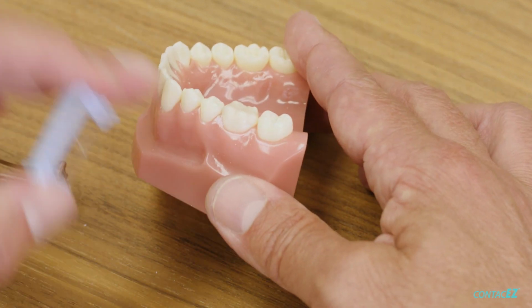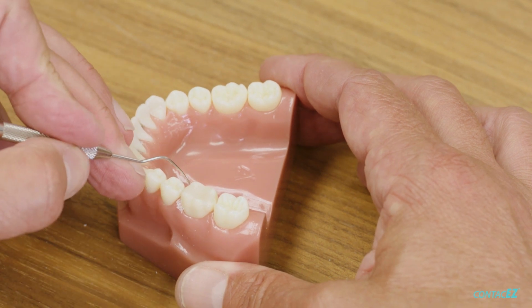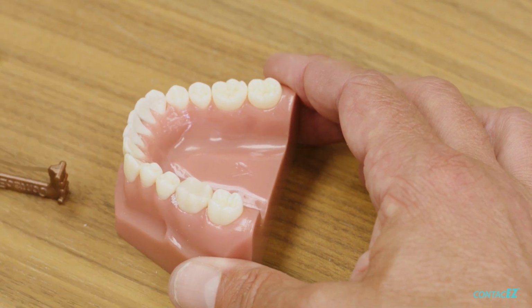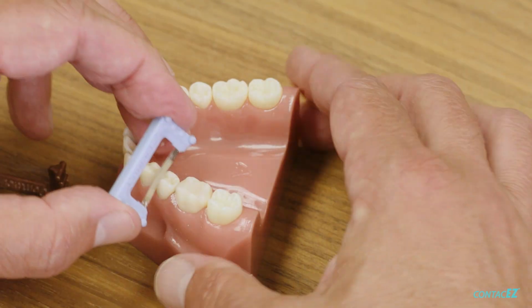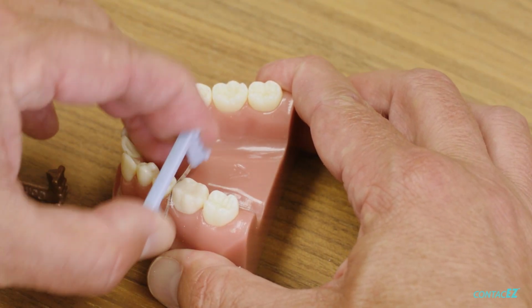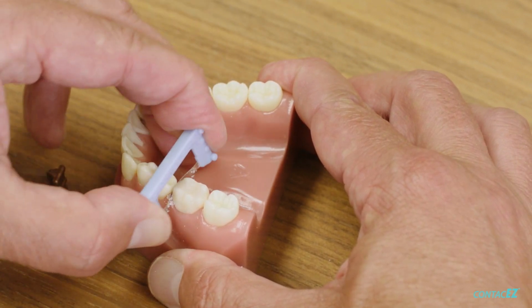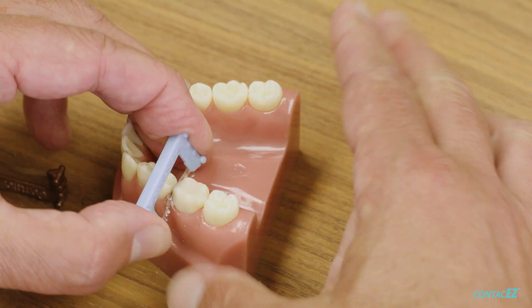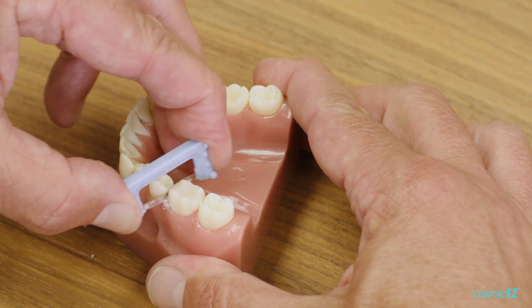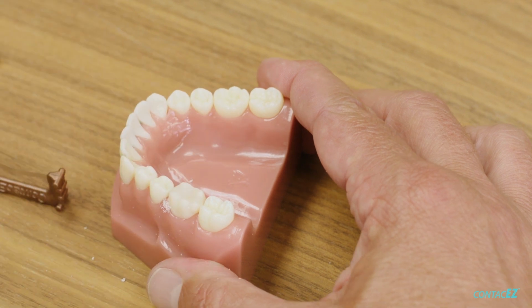If it was an amalgam, you could shoot a bite wing through there and see how it looks. If it's a composite, you can check again with your Explorer. Ooh, that's feeling better. Just a little bit more. And remember, I'll still be able to do some shaping with my gold strip once I get through there. But here it's more of a vertical motion, trying to cut down. Picture an overhang, a little donut of material at the gingival margin that I'm trying to cut through.